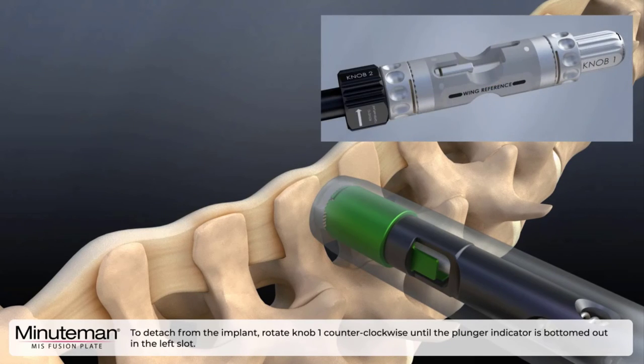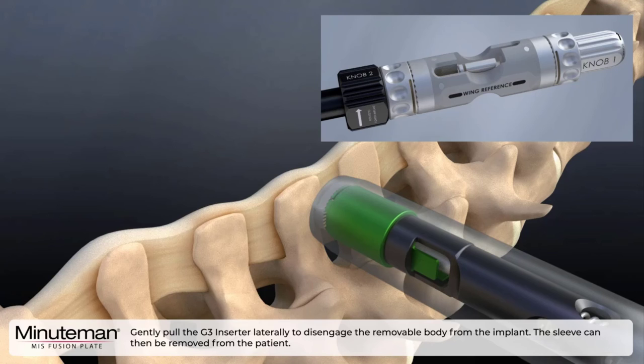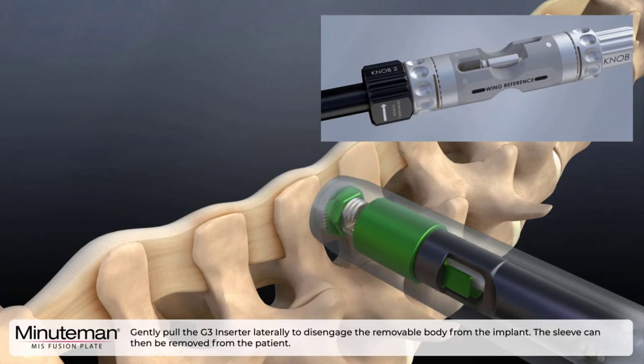To detach from the implant, rotate knob one counterclockwise until the plunger indicator is bottomed out to the left slot. Gently pull the G3 inserter laterally to disengage the removable body from the implant. The sleeve can then be removed from the patient.